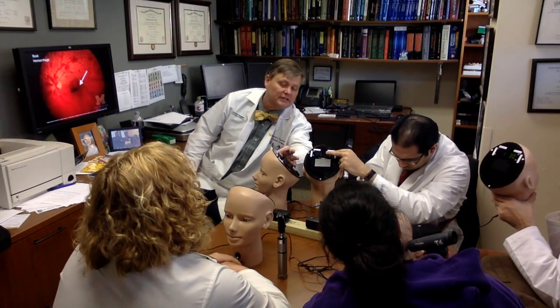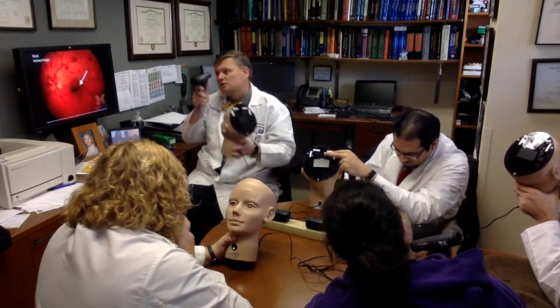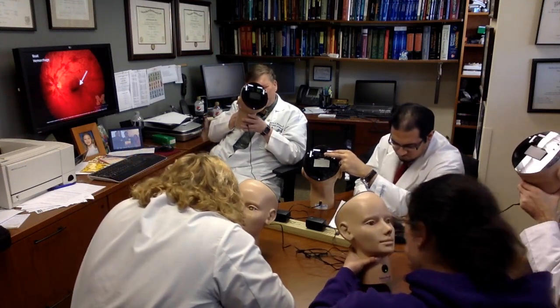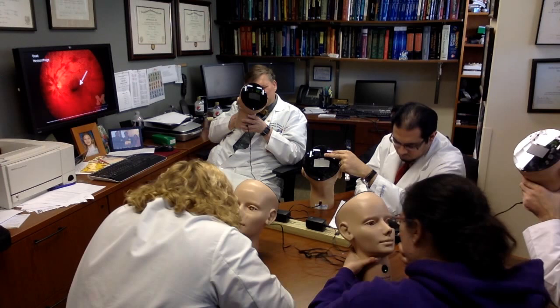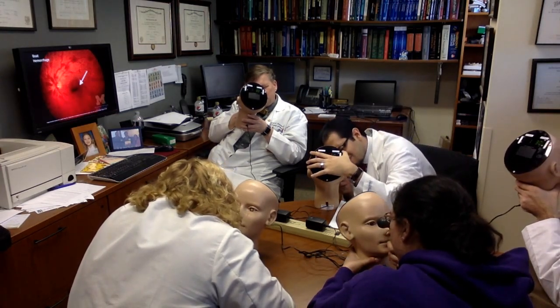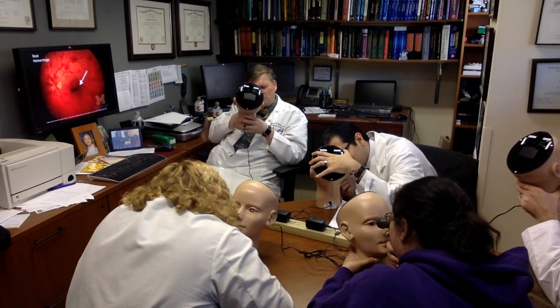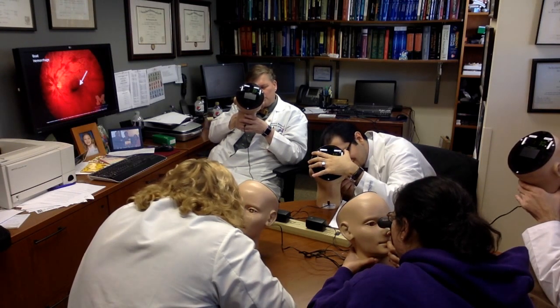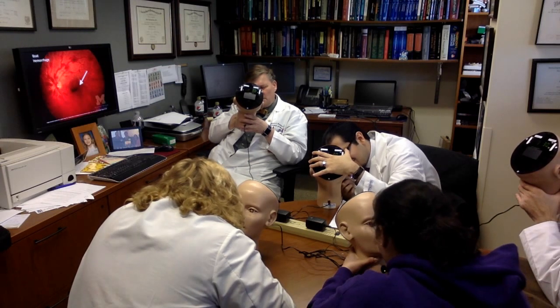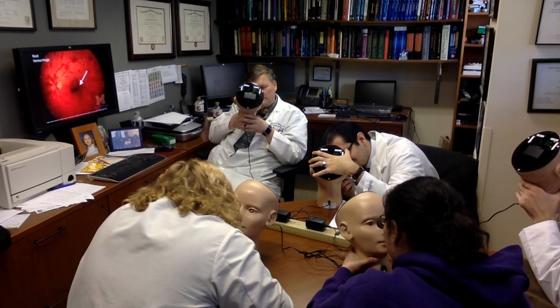Okay, focus in 10 feet away, and then why don't you come in till you see the red reflex. Okay, the red reflex, and then focus in on your disc or your retina. Oh, I can see the disc pretty well. Okay, but then in the retina, is there a problem? Yeah. There is a problem. Yeah, it's probably near the macula, exactly. Okay, does everyone see the lesion? Yep.